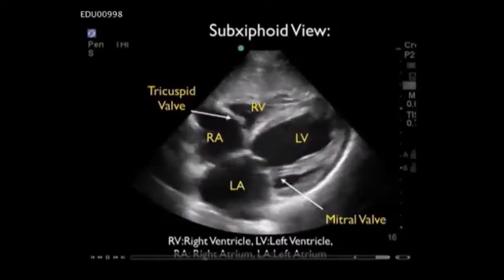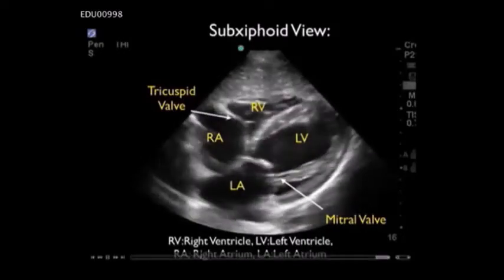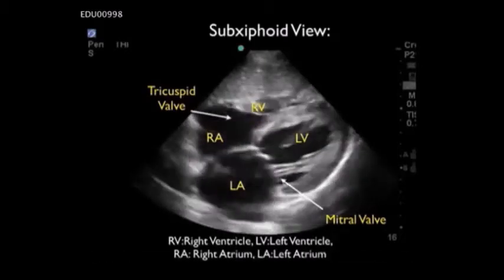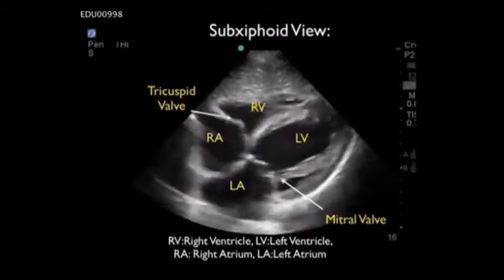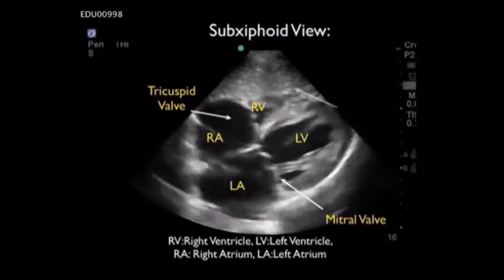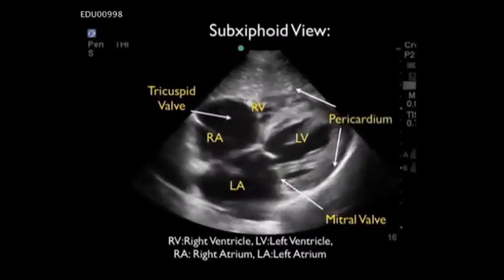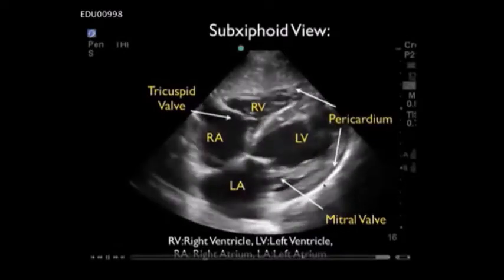We see the left ventricle, and with a small indicator arrow there, I'm showing the poor contractility of this left ventricle. Notice the poor percentage change from diastole through to systole. We see the left atrium to the left of the left ventricle and the mitral valve.